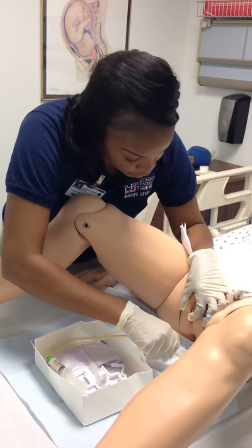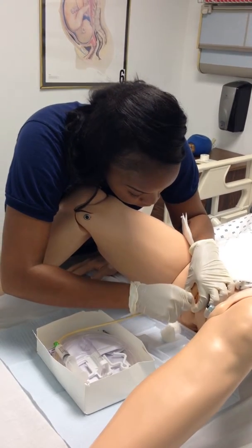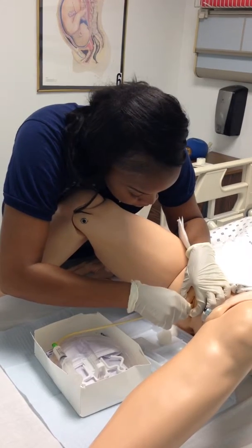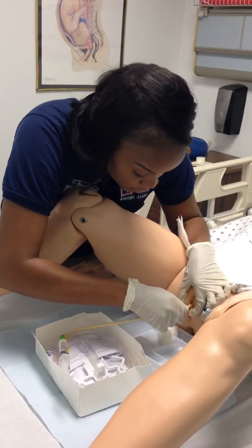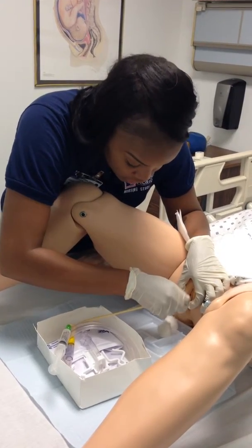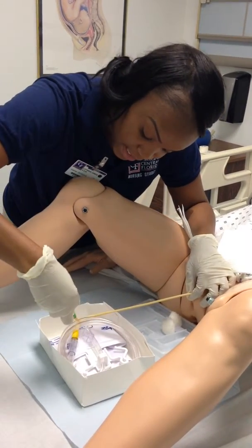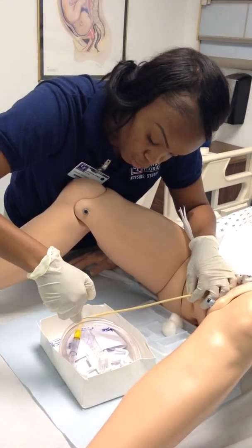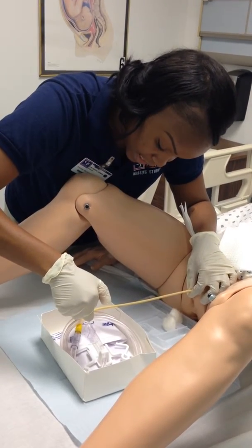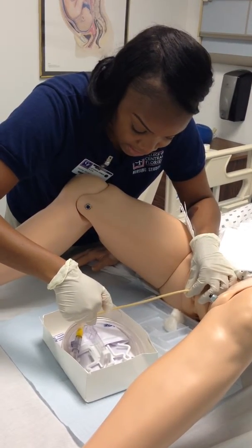Okay, Mrs. Jones, I'm getting ready to go in on the count of 3. 1, 2, 3. Now just go ahead and insert the Foley. Once I see urine, I can go in another 2 to 3 inches. Okay, I'm going to place my hand here to hold it in place. Go ahead and inflate the balloon. Make sure that the entire balloon is inflated. Before I take my hand off, I'm going to give it a little tug to make sure that it's in place. It is in place.